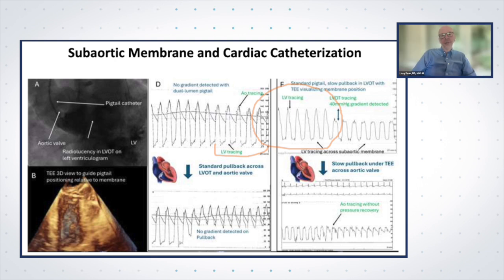Yeah, I share your question. I think we'll get to this at the very end as well. Sometimes these catheters, depending on where the side holes are located, I think this one may have been splayed out during part of this because of the catheter, as was mentioned a moment ago in the presentation. But it may also be due to the fact that it's sometimes hard to pick out, because you're talking about sometimes several millimeters between the aortic valve and the membrane.